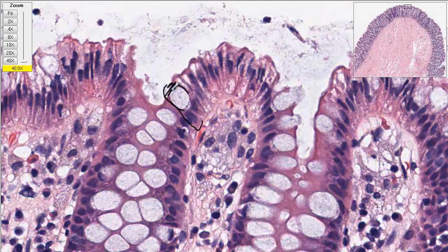So here it is. It's got a top like that, and then you see this wine glass. Oh, okay. So that wine glass there, that's the goblet. It's literally shaped like a goblet. I was circling the wrong handle. No, you got the wrong nucleus there. What's next to it, though, are these thin cells here, which do not have all the mucus inside of them. And these guys here are just these tall ones. Okay, and you only see the nucleus. The dark part is the nucleus. So the white part is just all this mucus inside of the cell. Right.